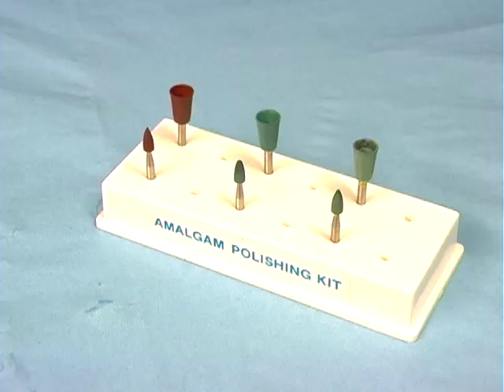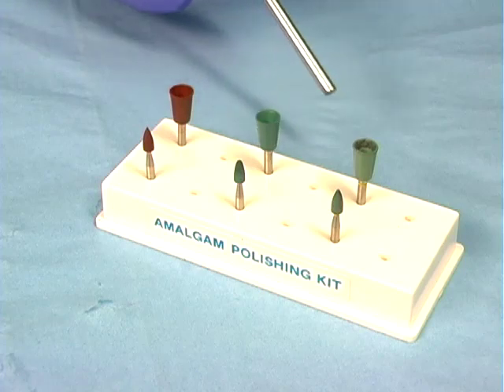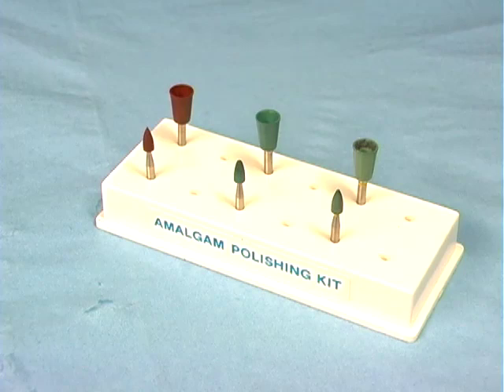We will be using the Shofu amalgam polishing system. There are points and cups in three stages of abrasiveness. The points and cups are called brownies, greenies, and super greenies. They will be used in this order, with the most abrasive brownies used first.